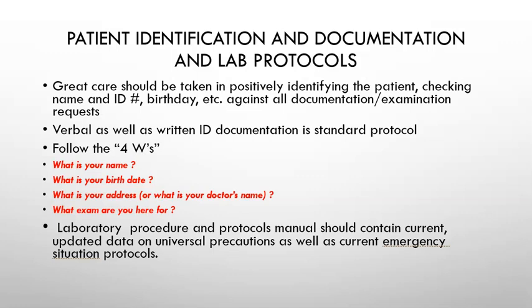Verbal as well as written ID documentation is the standard protocol. Make sure you follow the 4 W's. What is your name? What is your date of birth? What is your address? What is your doctor's name? What exam are you here for?